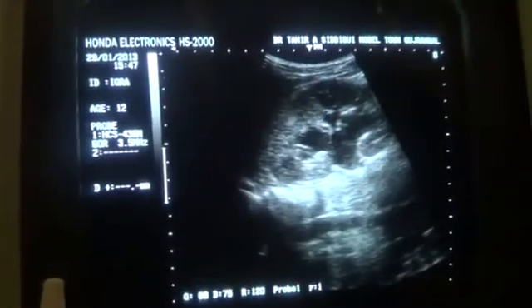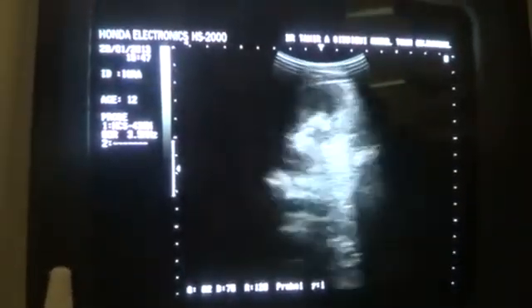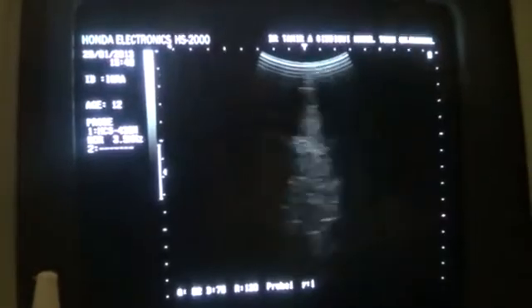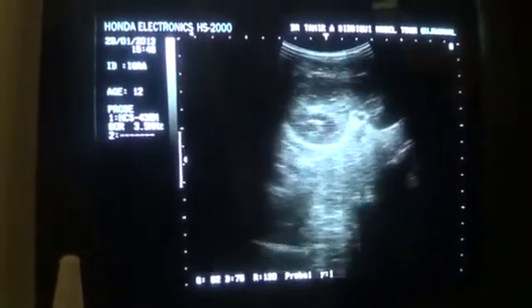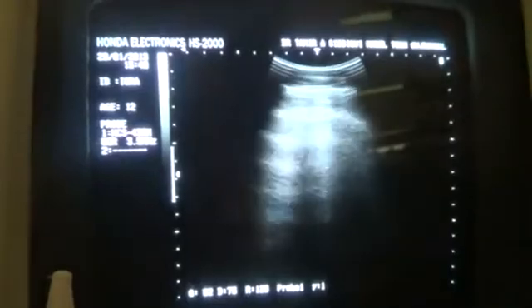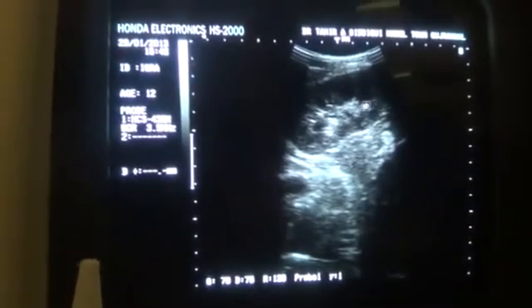Now, what is the status of the left kidney and the spleen? As I informed you, I had her drink a lot of water to see the pancreas. Now, this is the spleen. Spleen is normal in dimension. There is no evidence of any fluid above the diaphragm. This is the left kidney from prone posture. Minimal hydronephrosis, normal dimension, no calculus, normal corticomedullary differentiation. So there is hydronephrosis, but it is very minimal, not as much as you saw in the right kidney.